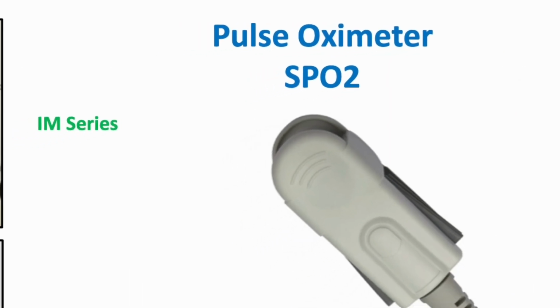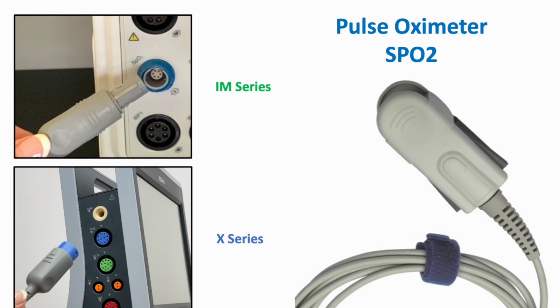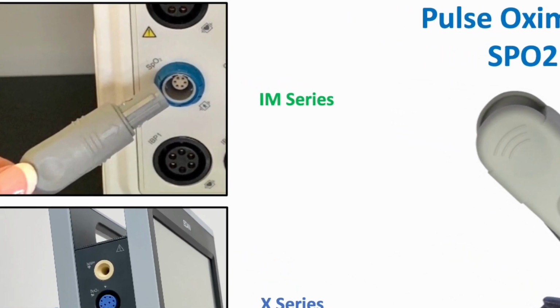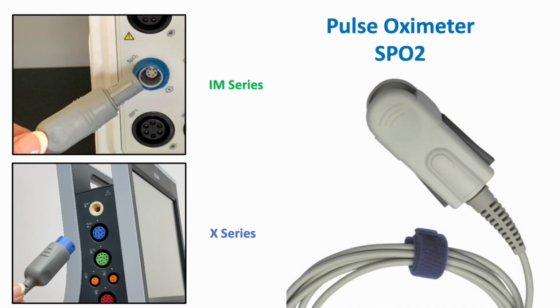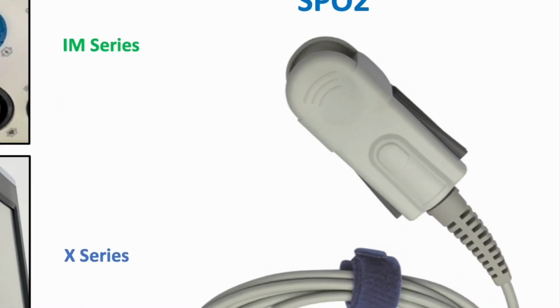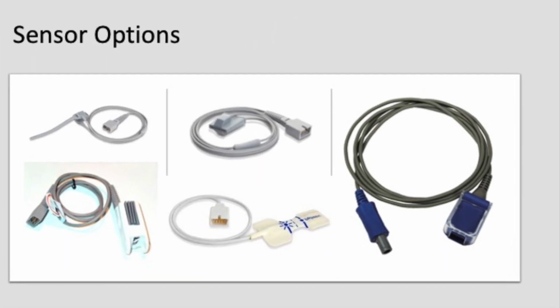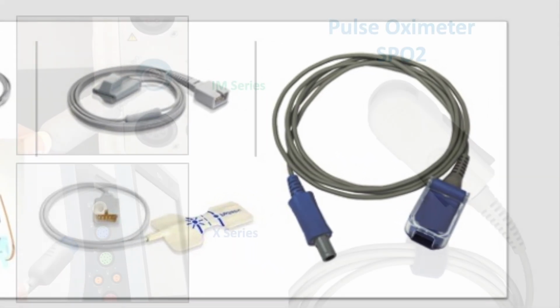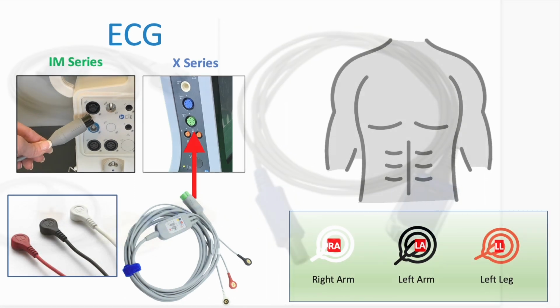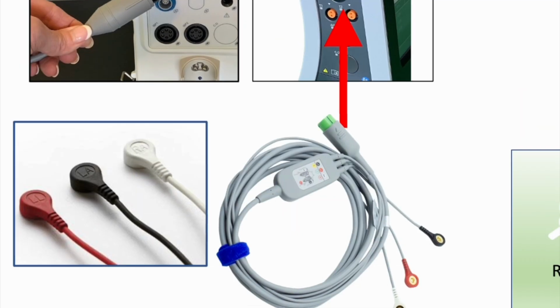Pulse oximeter. Connect the pulse oximeter cable by lining up the arrows on the sensor plug to the arrows on the SpO2 port of the monitor. This is important to avoid damaging the pins. The clip-style sensor is the most widely used. However, there are other sensor options available. If you choose to use multiple types of sensors, an extension cable is recommended to prolong the life of your equipment. ECG cable. Connect the ECG cable to the clearly labeled port on the monitor.